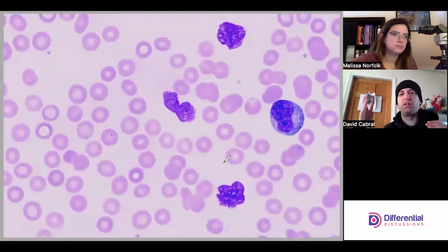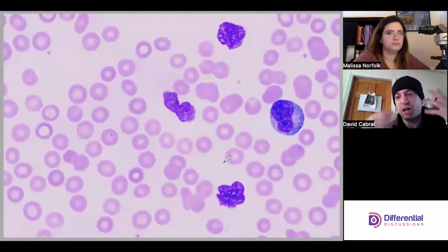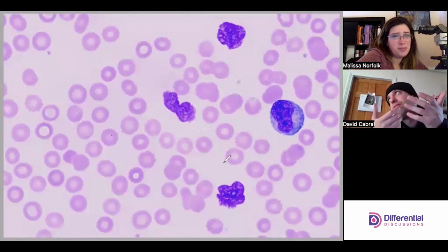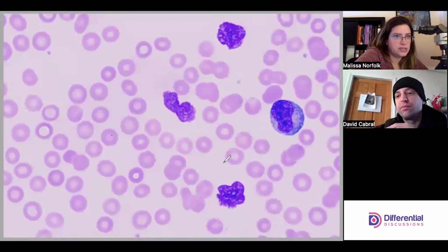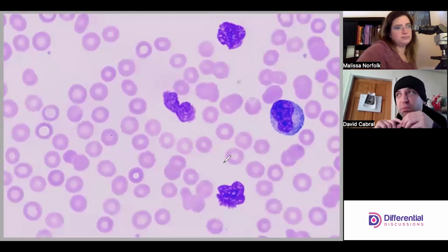But when you start to look, all the evidence starts to layer on top of one another. We saw a pro-lymph, the smudge cells, the number of mononuclear cells, and this soccer ball pattern now. It's all just like CLL, right? A number of mature lymphs, and pro-lymphocytes, you don't really see them in much else. Could you see them in an ALL potentially? But really that's more blasts. You don't see a lot of pro-lymphs for the most part with cases of ALL. So when you're seeing a pro-lymph, it's typically either a CLL or a PLL, pro-lymphocytic leukemia, which is very aggressive.